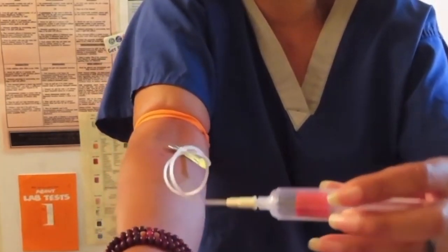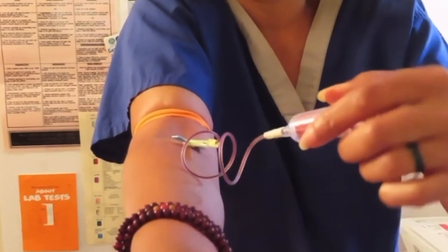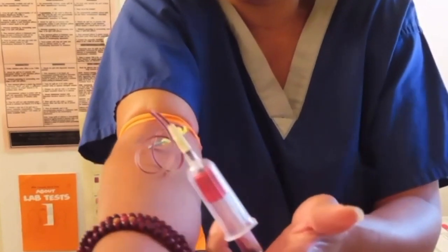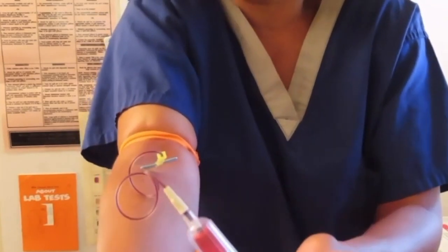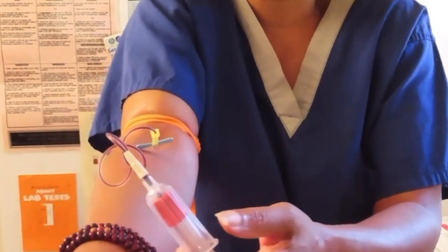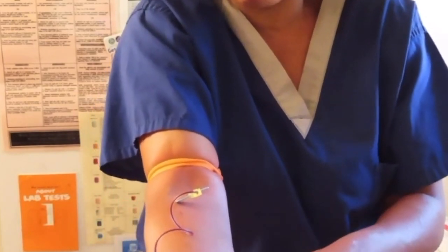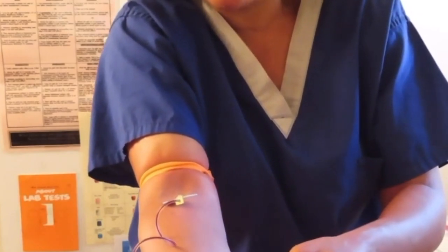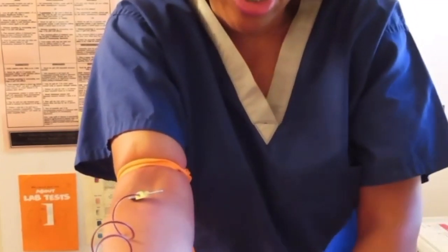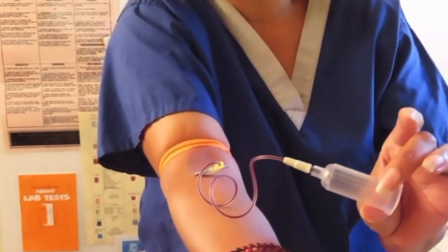Now because I have nice veins, I tend to always get the blood, right? But that's your middleman. All of that tubing is just a middleman, and we don't always need a middleman. Sometimes you think, oh, the patient's hard, it's going to be hard to get the blood. Well, it's going to be even harder if you use the butterfly for a difficult patient because of the middleman. Don't always rely on these butterflies. But most times you're successful, and you can be if they're easy patients. When they're difficult patients, the butterfly is not what you're going to always want.